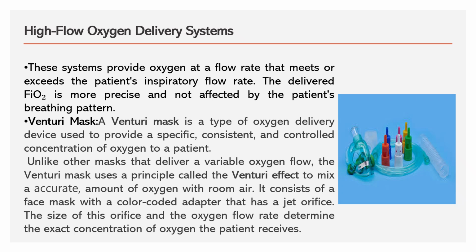Venturi mask is a type of oxygen delivery device used to provide a specific, consistent, controlled, concentrated oxygen to a patient. And it has a Venturi effect. There are different color coding adapters for this Venturi mask. Along with the mask, they come, and different percentages of oxygen FiO2 are administered to the patient according to the color code. Let's see one by one.